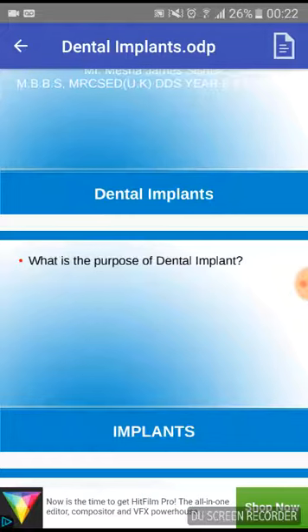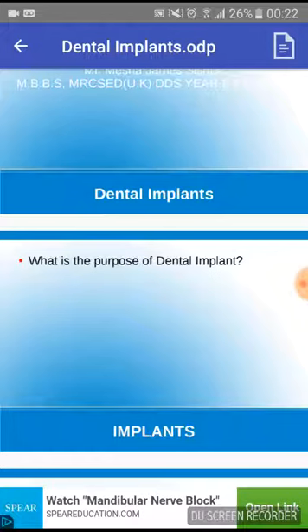So for the second procedure, local anesthetic is given, the gum is cut, and the protective screw from the actual implant is removed and replaced with a collar or metal healing cap. This healing cap allows the gum to heal correctly around the implant for about 2 to 3 weeks after the second surgery. So in the 1 step, the implant is placed in the jaw and remains exposed in the mouth.